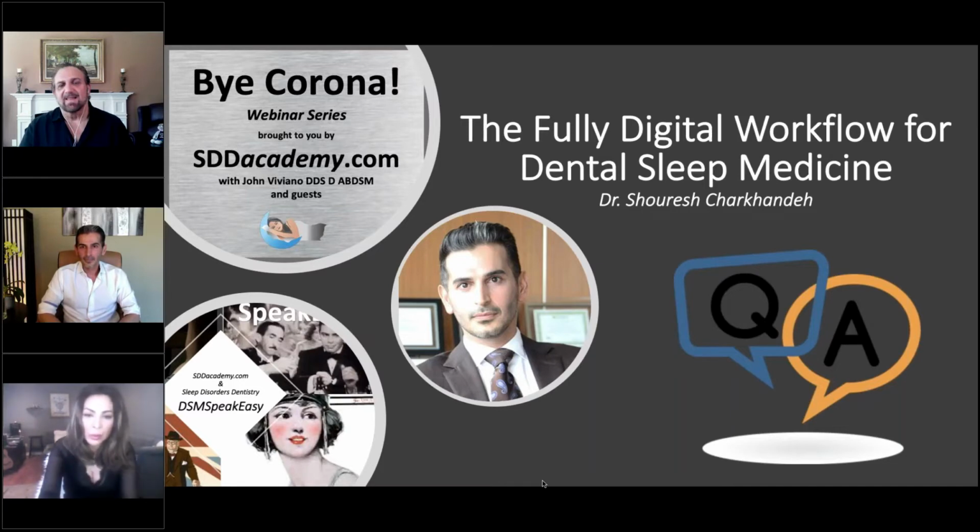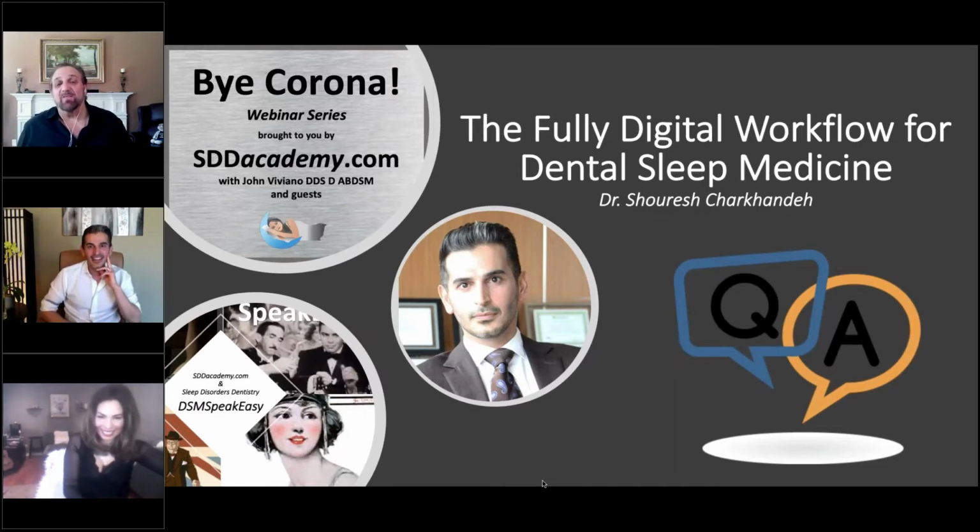And then we have a question from Kavita Narla saying, how to correct occlusal changes? I have noticed a patient wearing an appliance has no posterior contacts after wearing it for 3 months. The appliance was done by an MD. All right. John, do you want to take a shot at that one as well? We got an open bite in the back after 3 months of wear. Clearly, the jaw is probably a bit forward and not going back to habitual position.